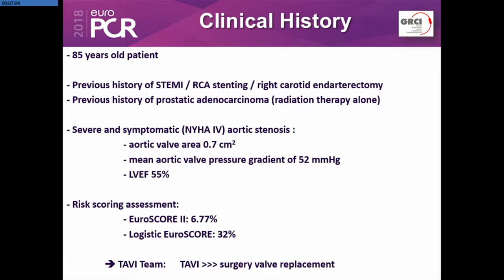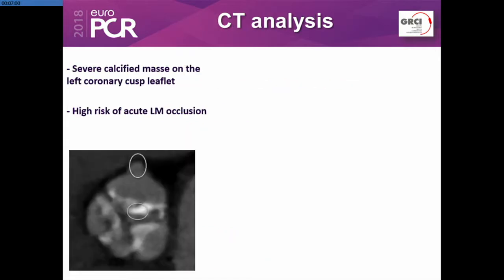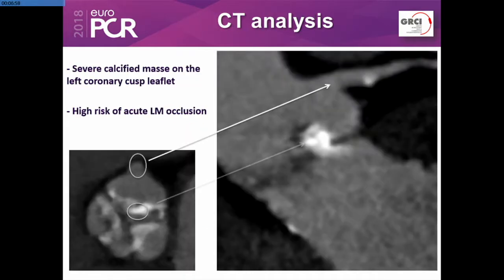Once the CT analysis was performed, I was concerned by a very large calcification located on the distal part of the left cusp leaflet.